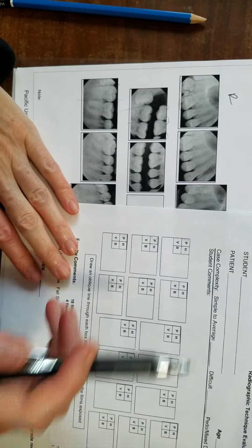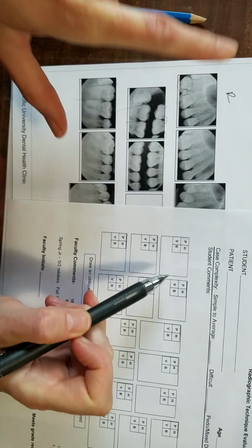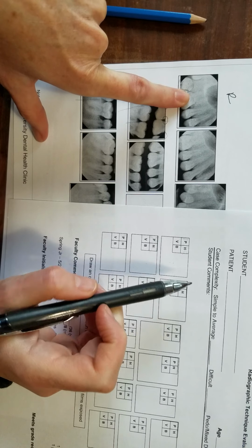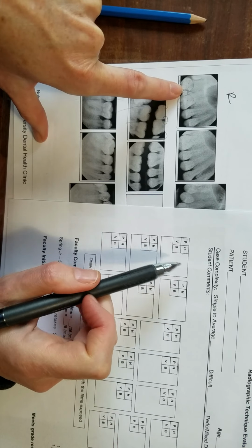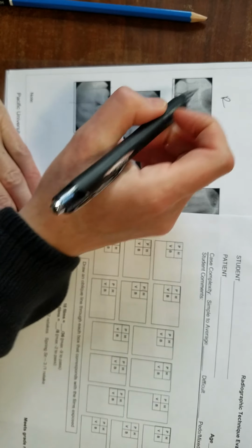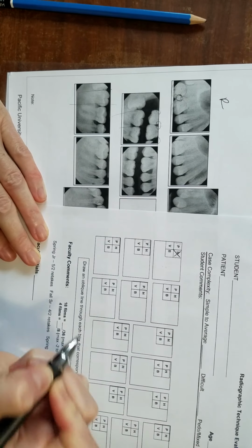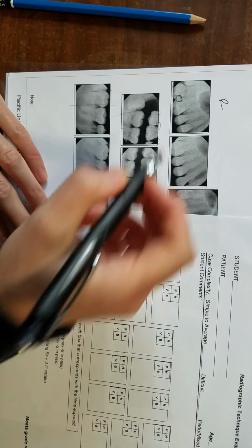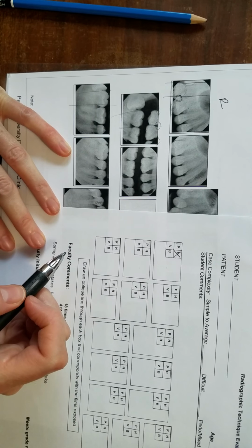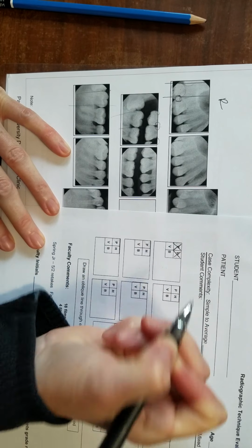So you just go to your upper right side. I'm looking at it as my left, but it's really my patient's upper right. And then you just critique it. So we look at this film, and I can see that there's a little overlap here. So I'm going to mark horizontal angulation. And then my second molar is way toward the back. My second molar is not centered. So I'm going to put a placement error.